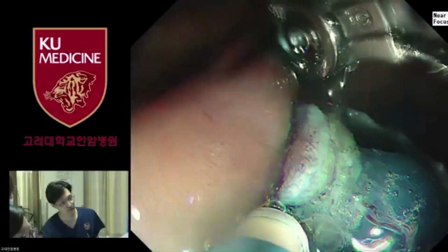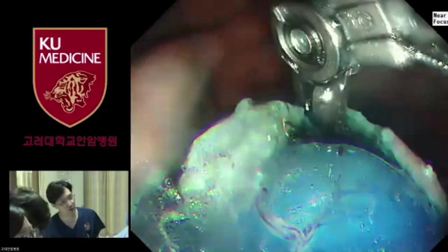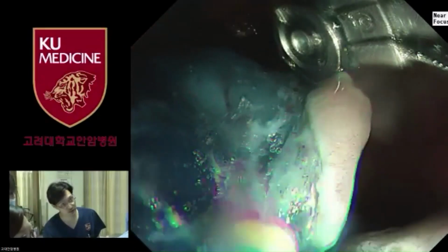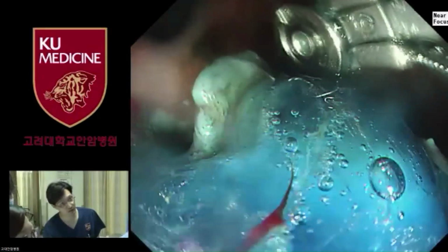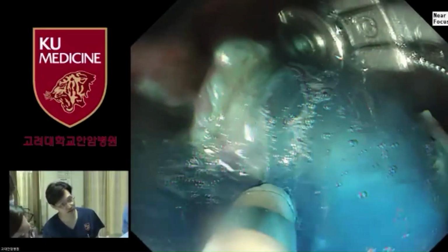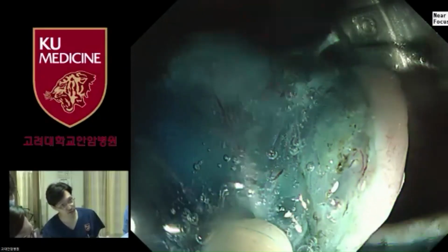Also, after finishing the ESD, we can show you the movement of this machine in the intragastric space, and how we can approach the body side and the lesser curvature side with this device, and how the arm can move after finishing the ESD.